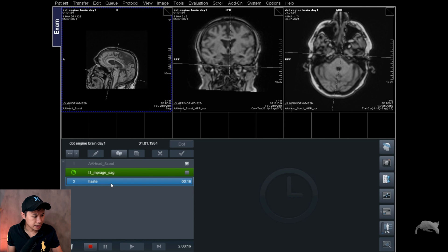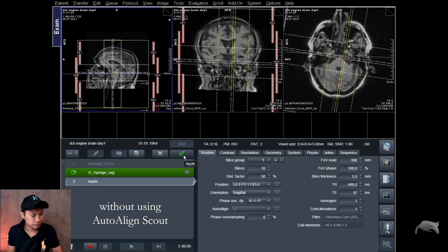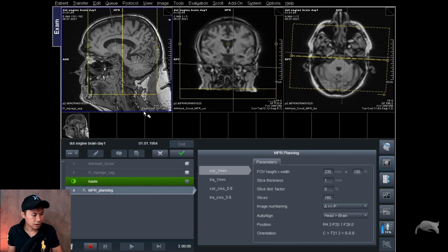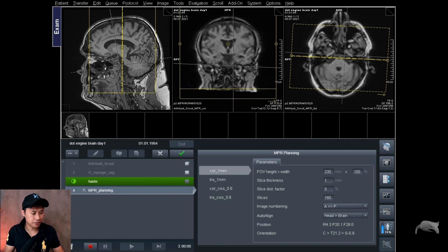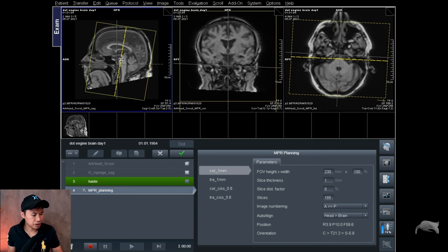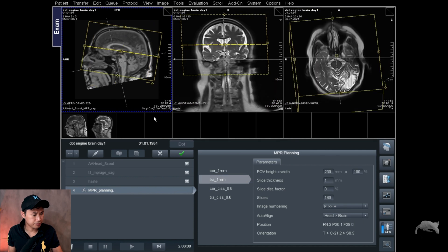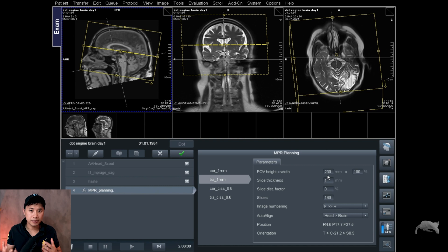We are finished with that scan. I'm going to do our standard HASTE localizer here just to show you how the tilted head looks. And at the end, I'm also using MPR planning. With this planning, it will automatically do the reconstructions for me whenever the sequence is done — very fast and efficient, and makes things more precise each time. What I'm going to do is choose the coverage in the coronal plane and in the transversal plane. Once I apply that, it will automatically make MPR planning for me in those two planes.